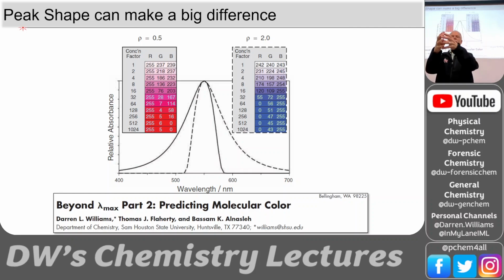So you have the RGB lab, and this is the second half of that. So if we simulate a spectrum of a molecule, we might get a lambda of the absorption, a wavelength of absorption, and to say that it absorbs at 500 is going to give you a certain color can be misleading if your peaks are asymmetric. So this peak here is at 550 nanometers, okay?